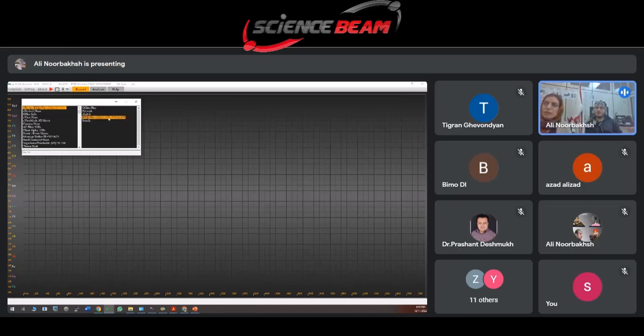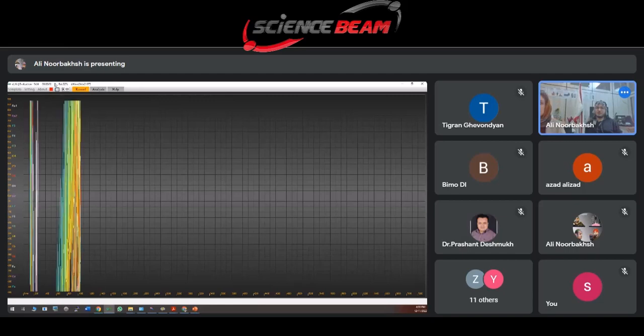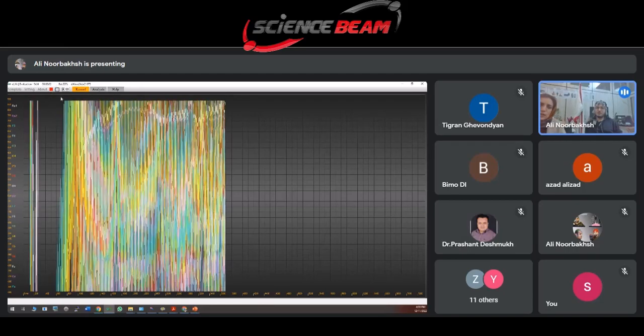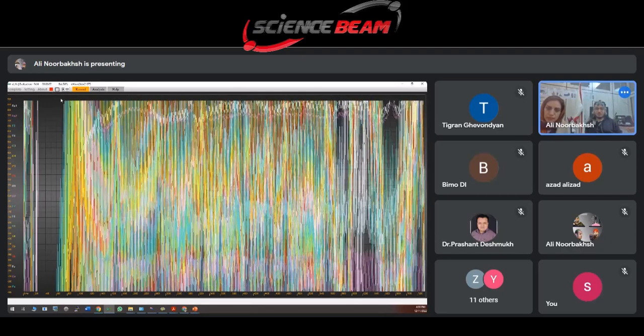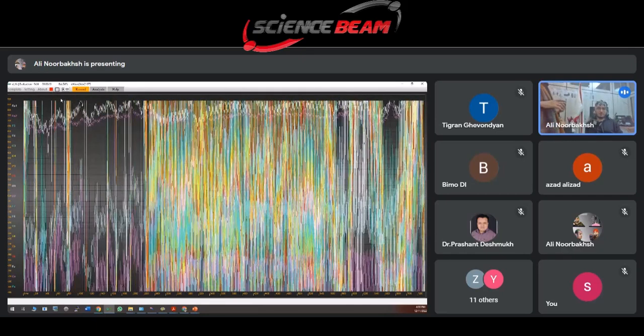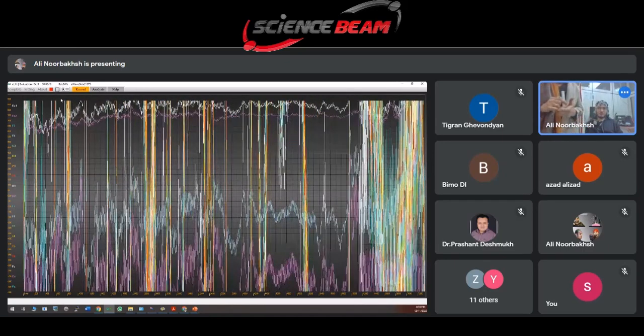Now it's fine. Then we should close the software and play it. You can see noise. All of the points have a noise. Okay. When we inject gel, we can see a good signal.